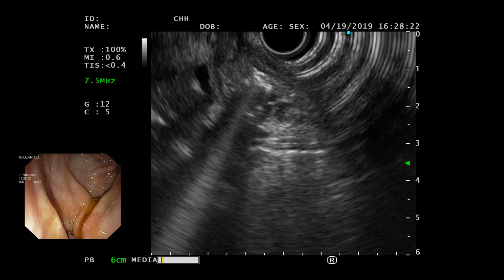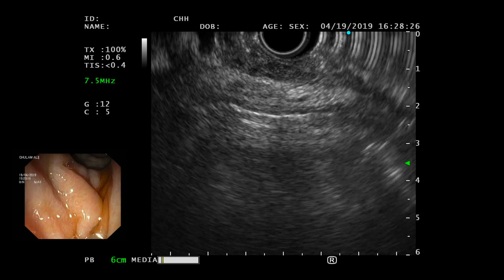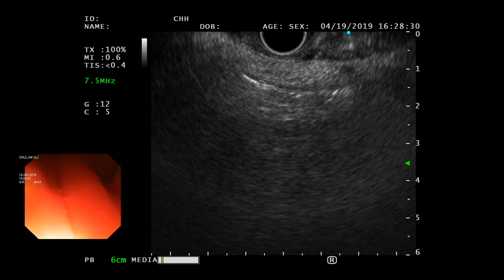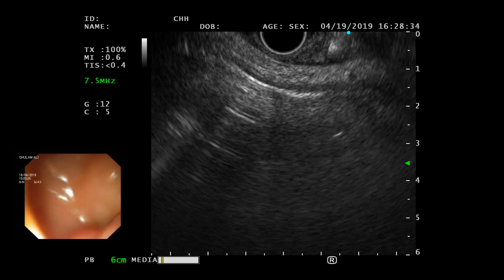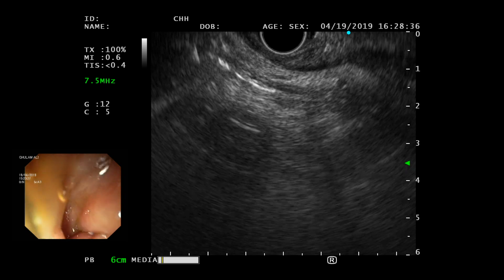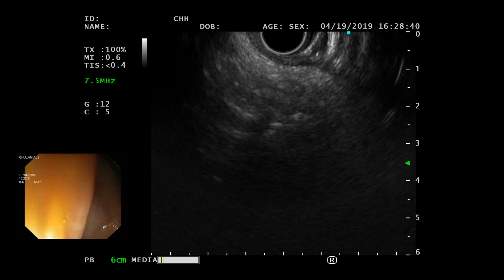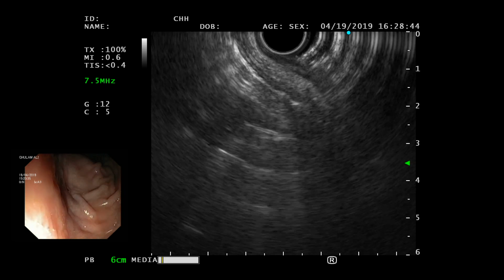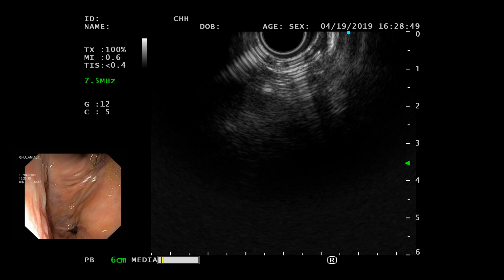Okay. Good. Can you see it now, okay? No, stop here, because if you push, you will bypass it, okay? And big wheel away from you. Big wheel a little bit more away from you. Small wheel away from you too. And now gently advance. Now let it come back again. Come back a little bit. Come back. Right there, okay?